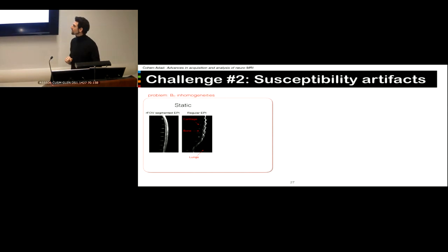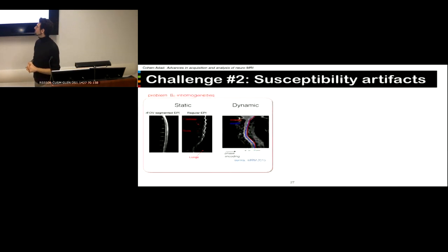There's another effect which we call dynamic B0 offset. When you're in the scanner, usually we image living people, and those people breathe, and when they breathe, they fill their lungs with oxygen, which is slightly paramagnetic, and since this is paramagnetic, it will also have an impact on the B0 field. And basically you end up having a B0 field varying with time.